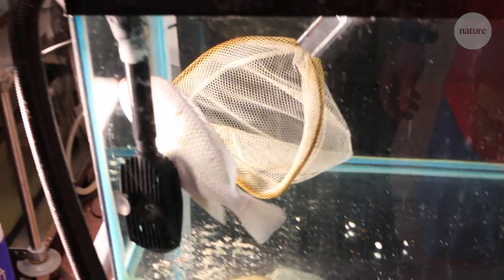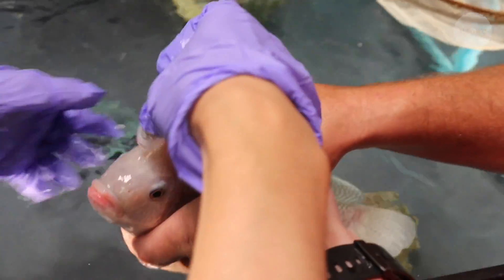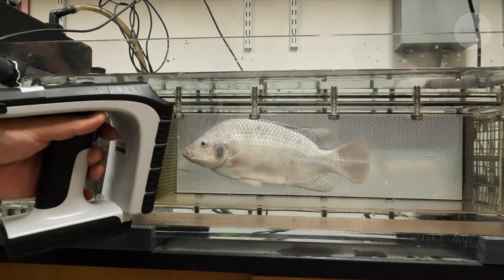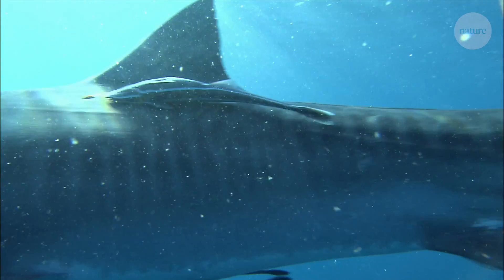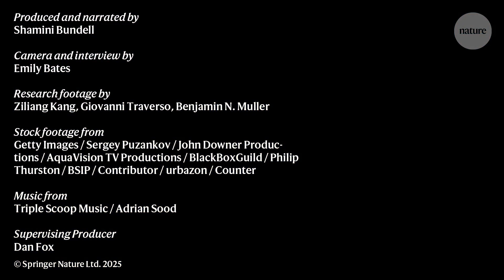The team even went full circle and tried out their suction device on a fish. They attached a little temperature sensor onto a fish's skin and wirelessly collected data from it. The device stayed stuck tight, even in fast-flowing water — just like the remoras it's based on. And all this from a design borrowed from a sucker fish.